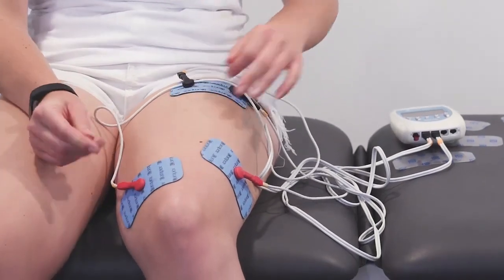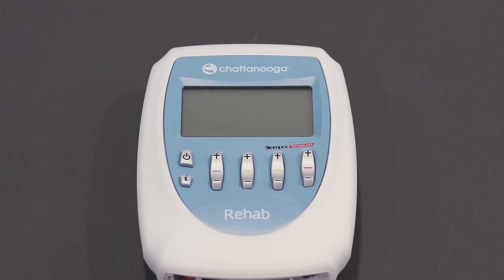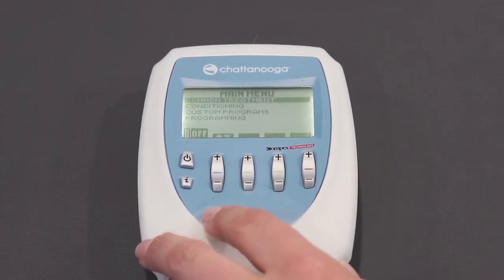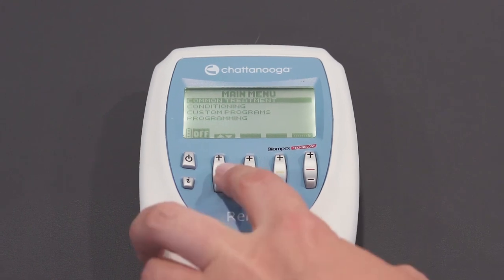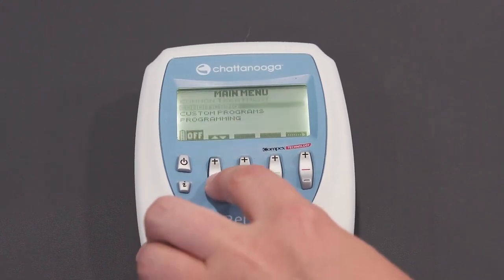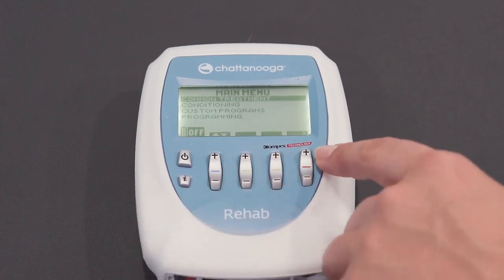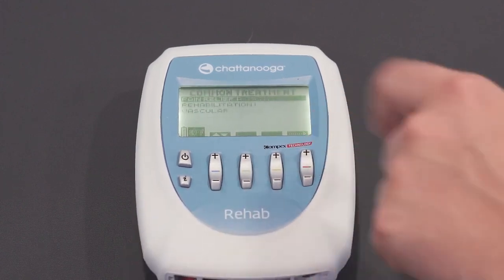To begin your first session, take the handset and press the power button. We have come to the main menu starting with common treatments. The first button to the right of the power button is the scroll down menu. The far right hand button is the enter button.